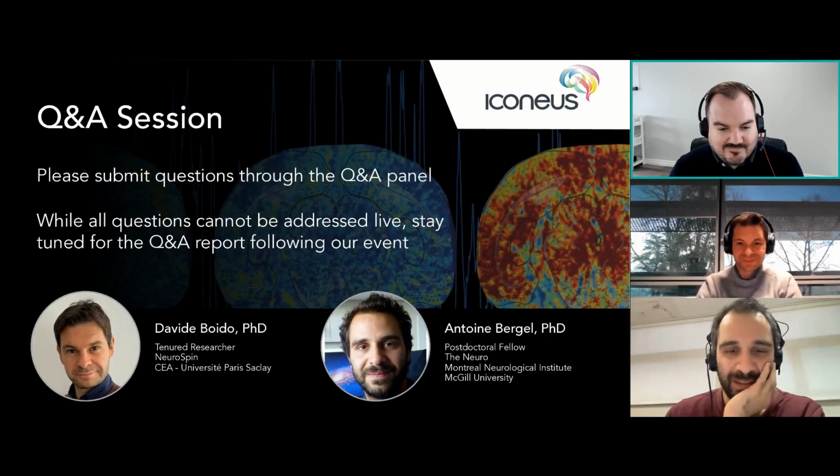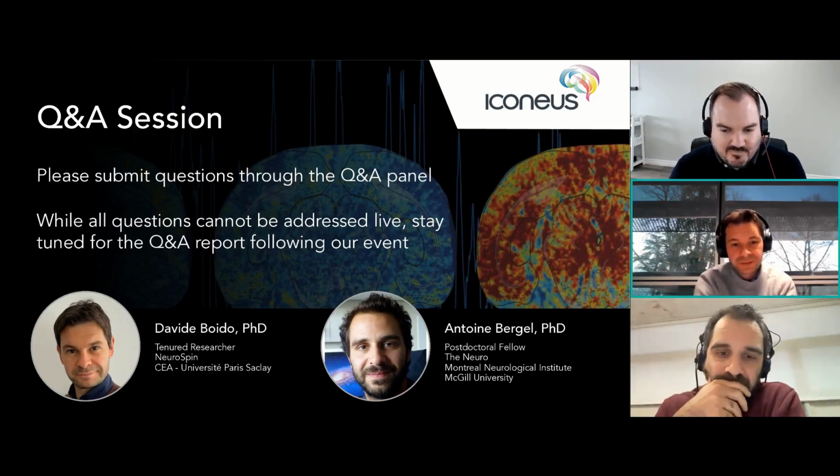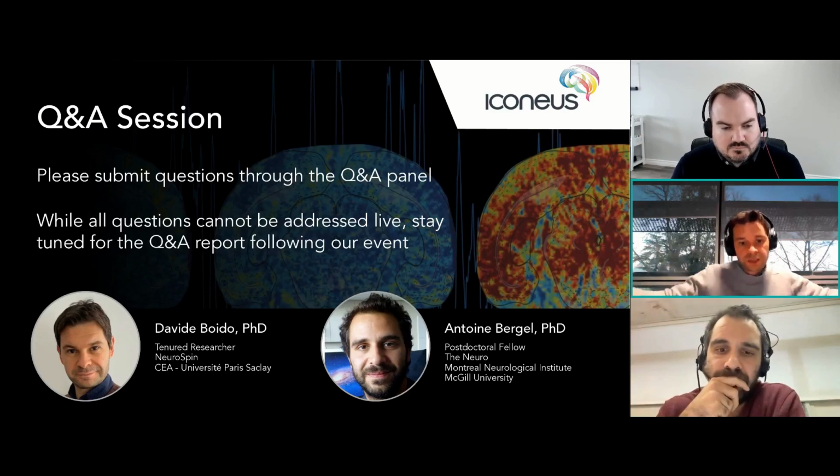Do you want to take it, Davide, or? I can start at least. So, sure. Of course, no argument. The craniotomy is an invasive approach. So for sure, we are not dealing with a brain which is completely preserved. But from another point of view, we do the craniotomy and we use these covers in order to run experiments over time. So we give the mouse or the rat enough time to recover not only from the surgery but also from any kind of manipulation that we can do of the brain.